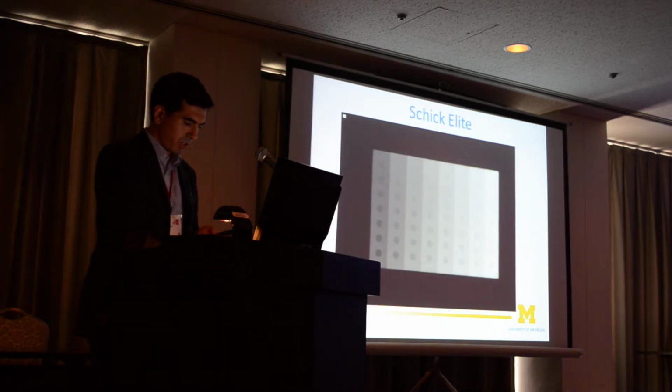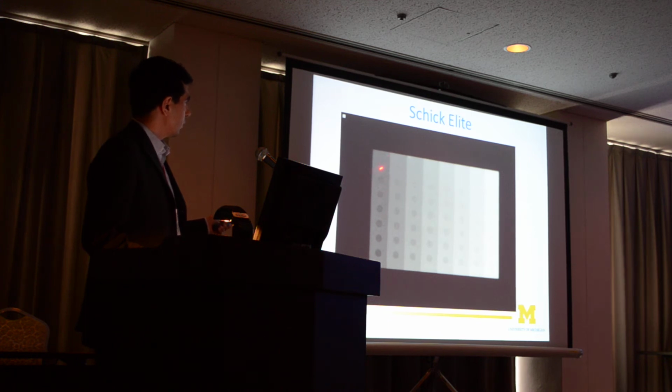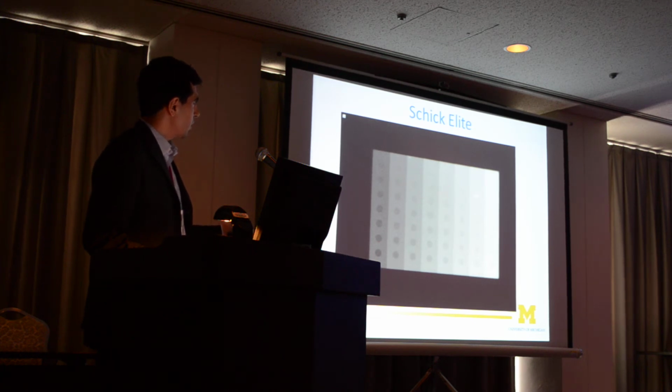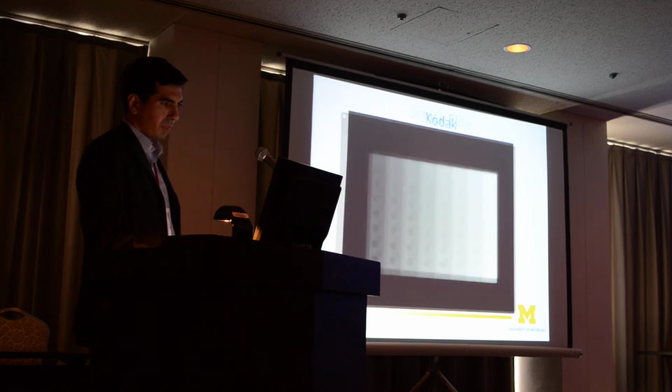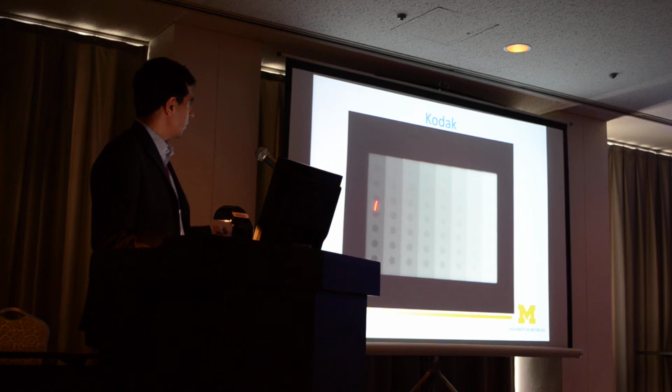Here are some of the images that we got. This is the Schick Elite, and you can see the dots 1, 2, 3, 4, 5, 6, 7. As you go, you miss some of the dots. You are able to see the other dots. This is another example from the Kodak sensor. Again, you can see the 7 dots, but as you go higher, you lose some of the definition in that area.